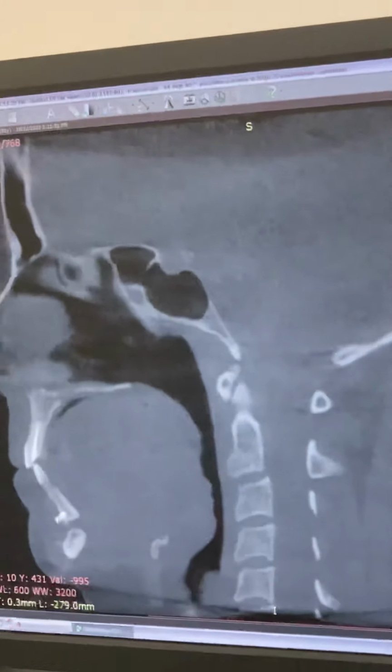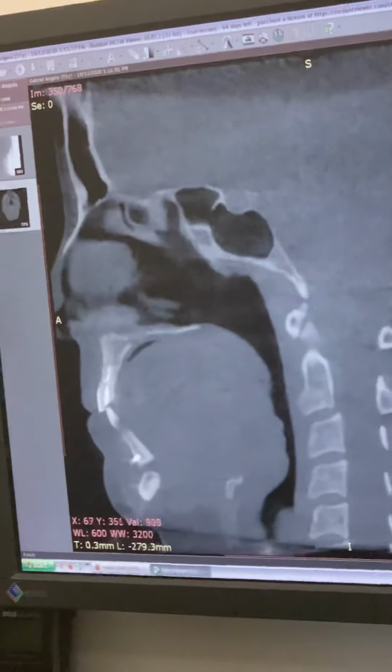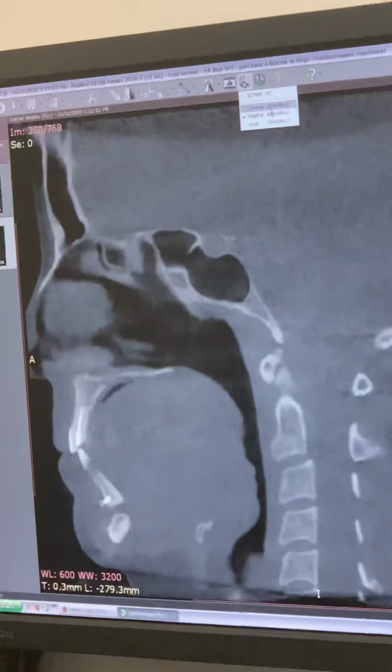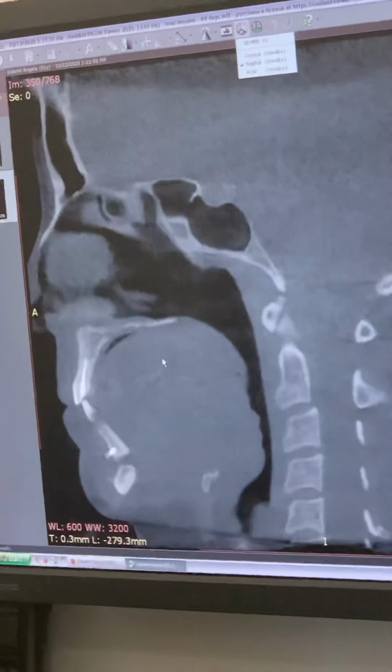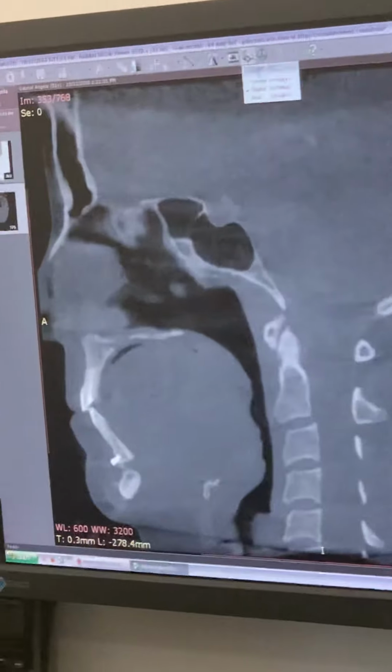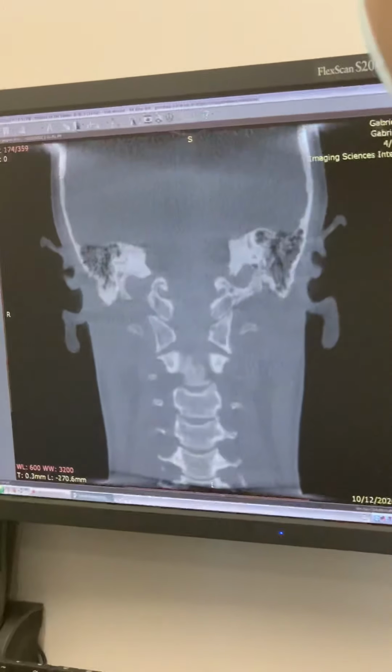We can also see that you've had some root canals here, often consistent with clenching and grinding. So we see you've had Genioglossus Advancement, but not that. Maybe you were worse and now you're better, but still not enough. So let's take a look at this image here.